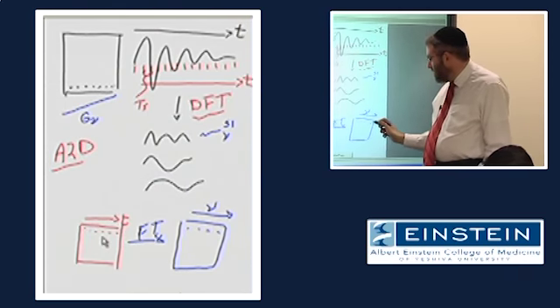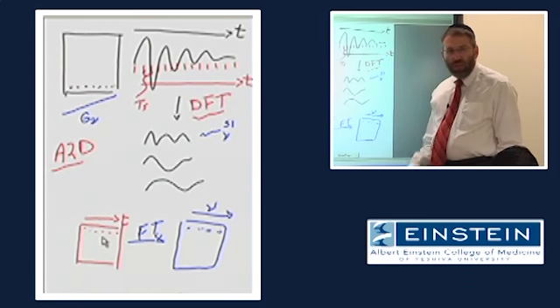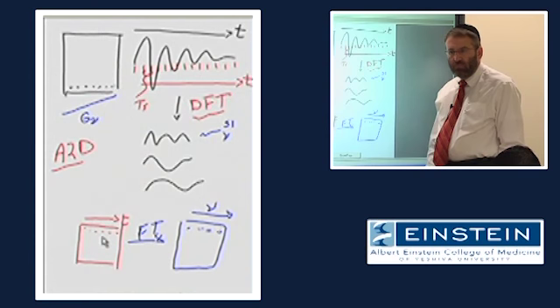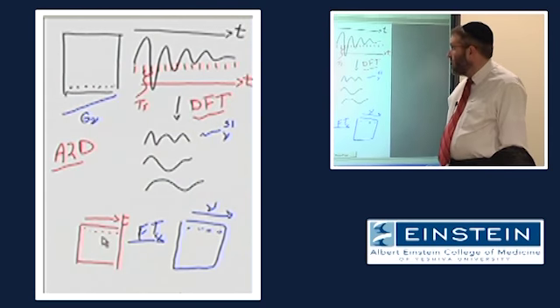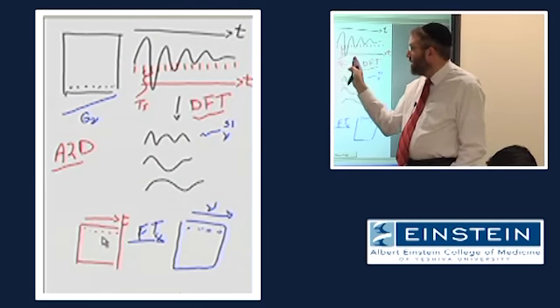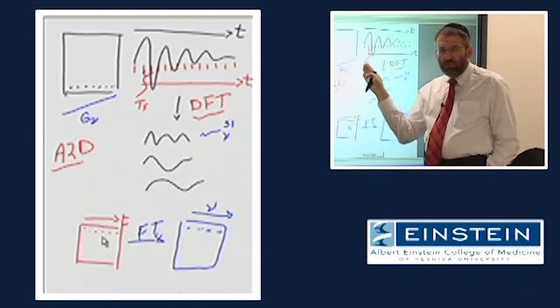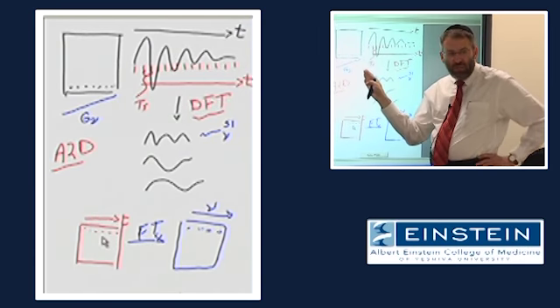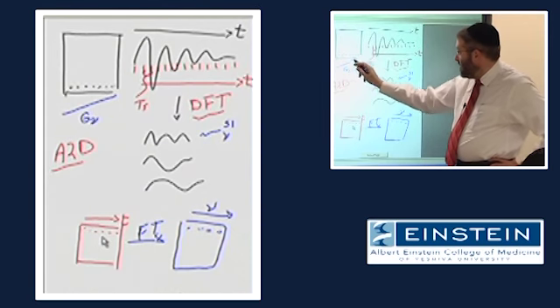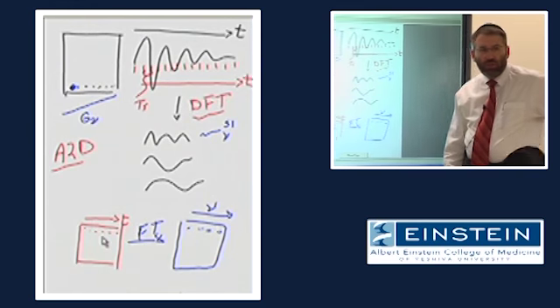And once we do this, we can then take those measures of signal amplitude and put them in the right location in the image. Now, this allows us then to localize signal along a second linear dimension in our image. A single linear dimension, in the plane of the image. So I know how much signal amplitude, let's say, comes from this location in the left-right direction.